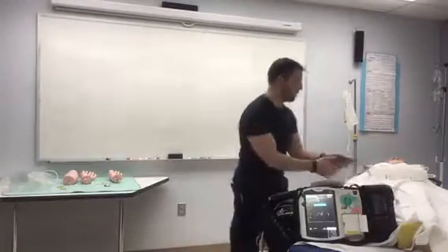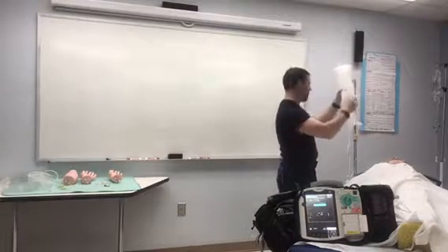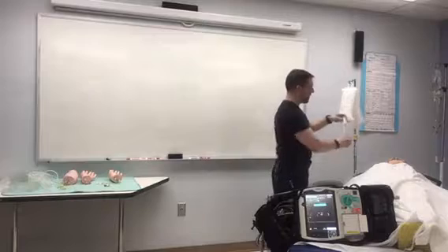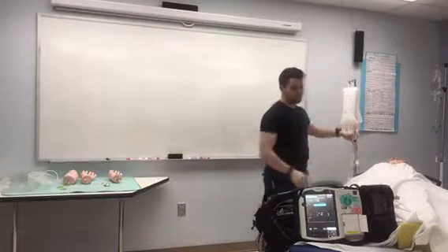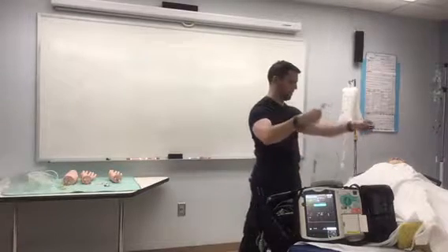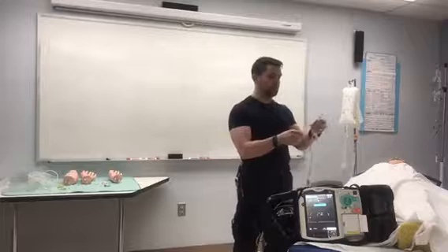Okay, so the very next thing that we need to do is we have our pressure bag up, we have confirmed our pressure, we have all the air out of our line. So this half of the line is set at 300 millimeters of mercury.